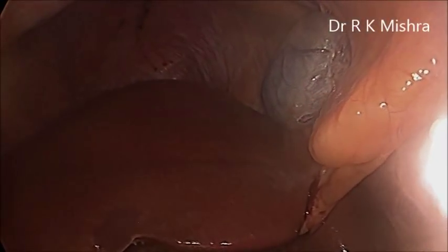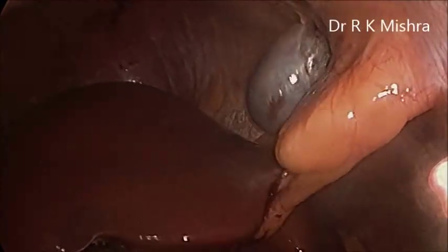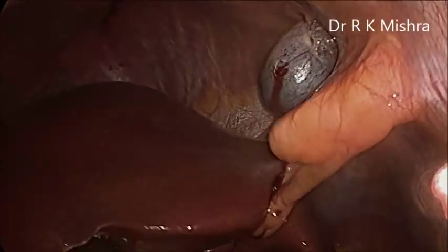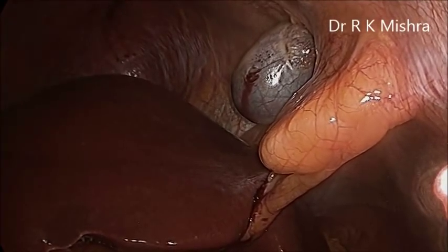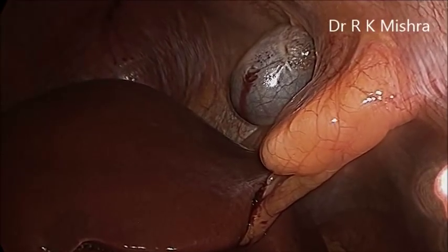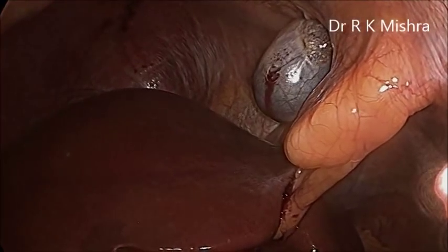Now in this there were multiple big stones. So after sucking it, you can cut the neck, you can tap it a little bit so that the floating neck of the gallbladder will come out, and this is just a tapping so that it can be taken out, and then you can take the ovum forceps and slowly pull all the stones out. While taking the stones out, you have to surround it with this sponge so that it does not touch the wound, and care should be taken.